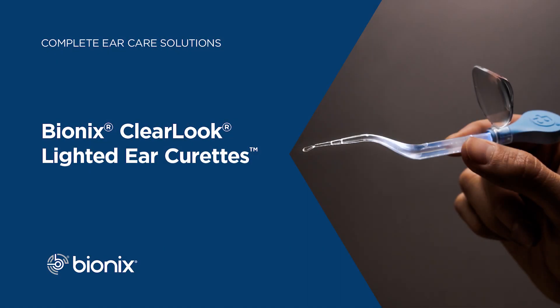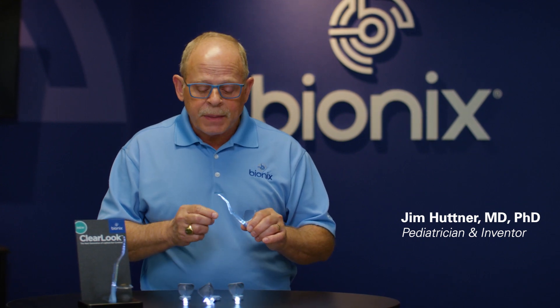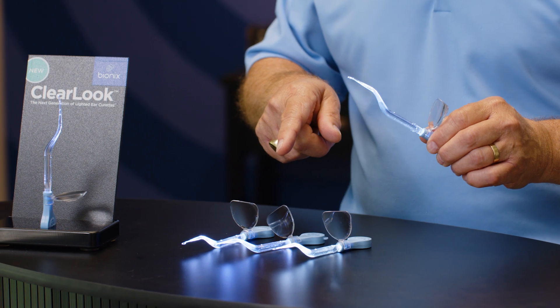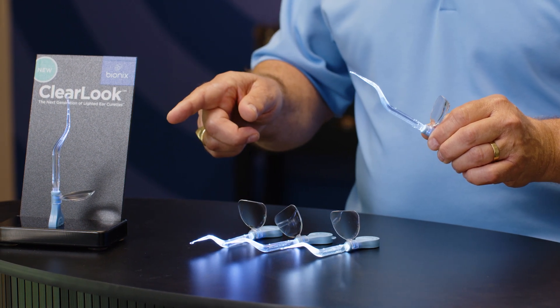The Clear Look Ear Curettes are the next generation of lighted ear curettes from Bionics. We have five different tip styles similar to the ones we have with our other lighted curettes: the Micro Loop, the Infant Scoop, the Versa Loop, the Angle Loop, and the Flex Loop curettes.